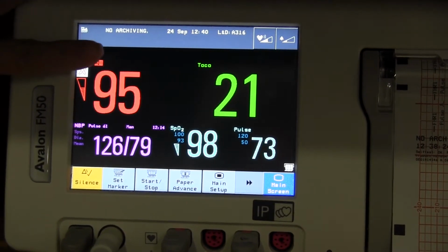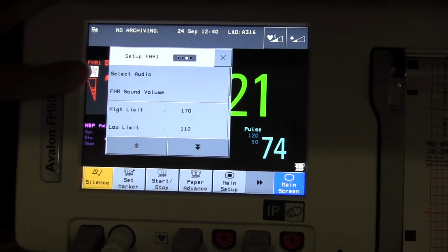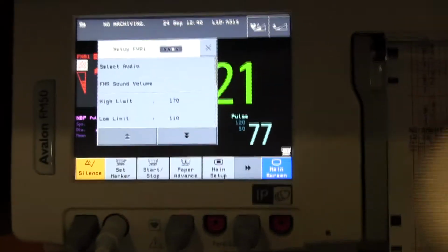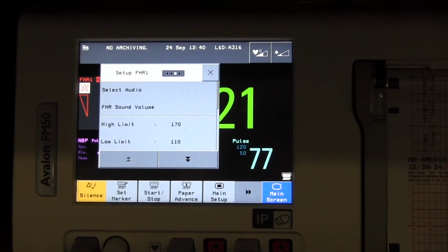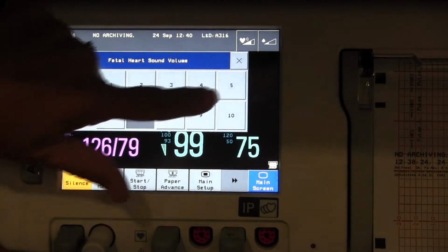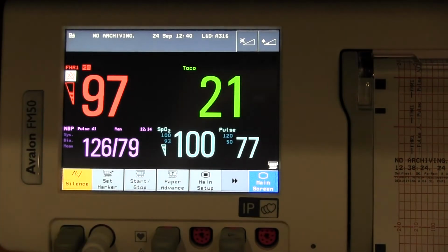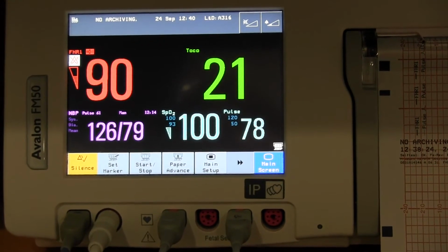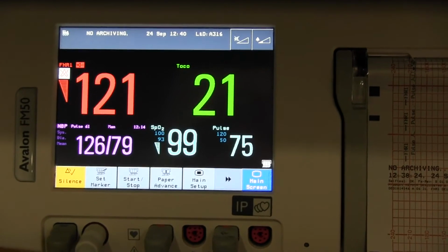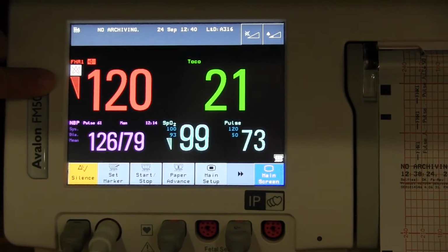Touch the tone volume symbol to open the fetal heart sound column menu. Note that the first thing displayed on the menu is the location of the socket that is being used. Also note that the blue light on the ultrasound transducer comes on. Change the fetal heart sound volume to different volumes. To close the menu, use the X in the upper right corner. Underneath the fetal heart rate symbol, you will note a signal quality indicator. When the signal is at its strongest, the indicator will be completely full.